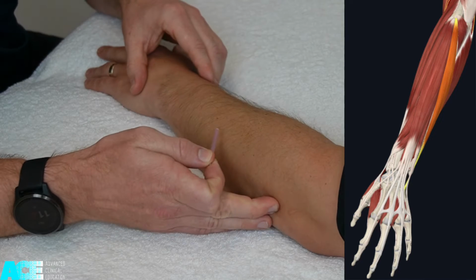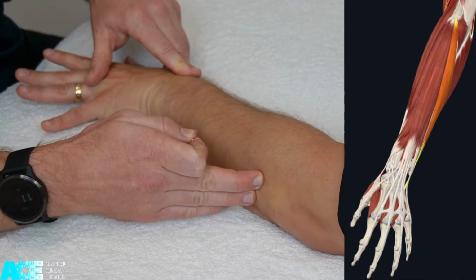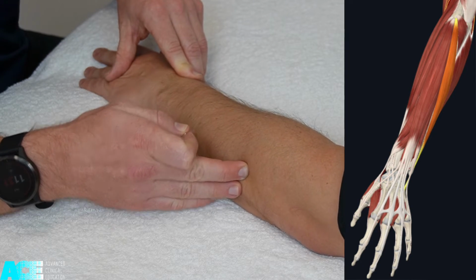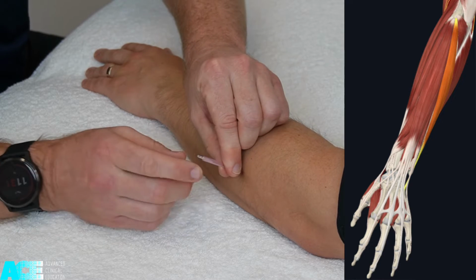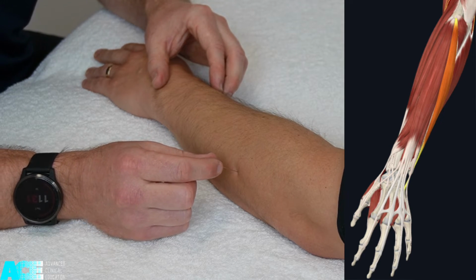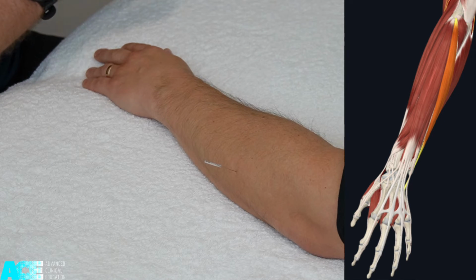To start with the extensor carpi ulnaris muscle, again, we can ask our patient to activate the muscle by using ulnar deviation of the wrist, palpate through the muscle, find the tender spot, and then the needling direction is perpendicular to the skin, directly into the belly of the extensor carpi ulnaris muscle.